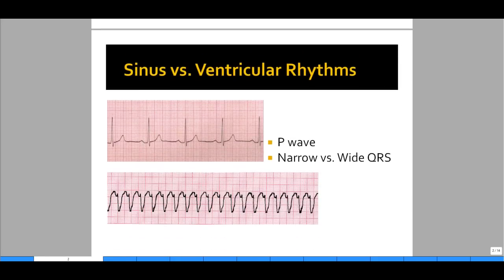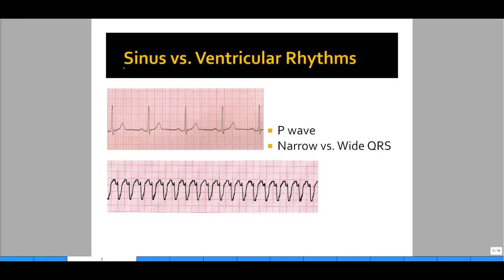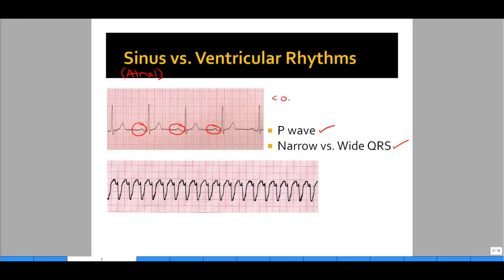Let's look at how to differentiate sinus versus ventricular rhythms. When we say sinus rhythm, we're asking: does the rhythm originate from the atria of the heart versus from the ventricles? To differentiate between these two, we look at two major characteristics — the P wave and the QRS. If you see a P wave before every QRS, you know the rhythm is originating from the atria. Second, if the QRS interval is narrow — meaning less than 0.12 seconds — the rhythm is originating above the ventricles, meaning AV node or higher. If it's wide, as in the rhythm strip below, the rhythm is actually originating from the ventricles themselves.